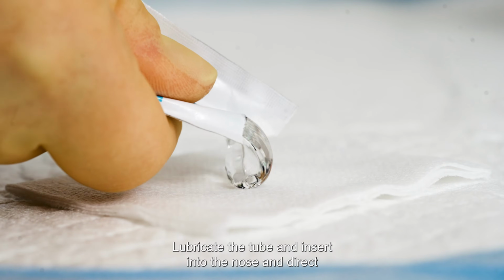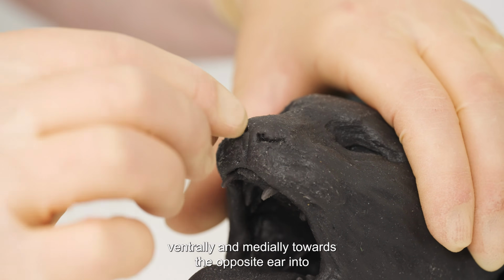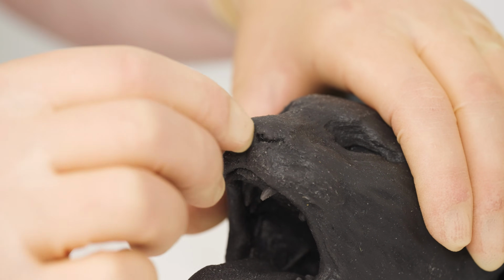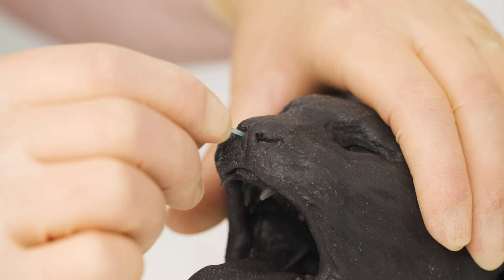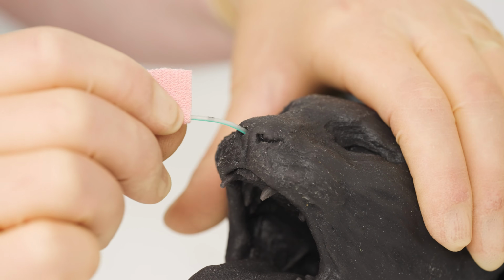Lubricate the tube and insert into the nose and direct ventrally and medially towards the opposite ear into the ventral meatus. The tube should pass easily and without resistance. The patient may swallow when the tube passes the oropharynx.